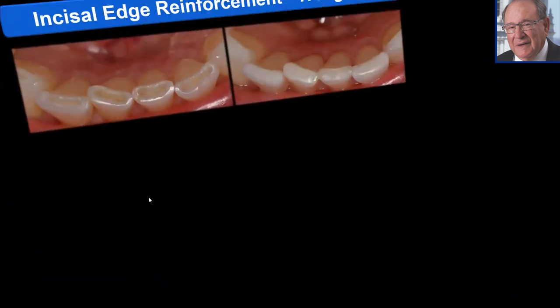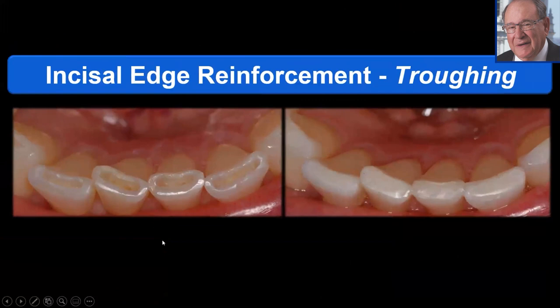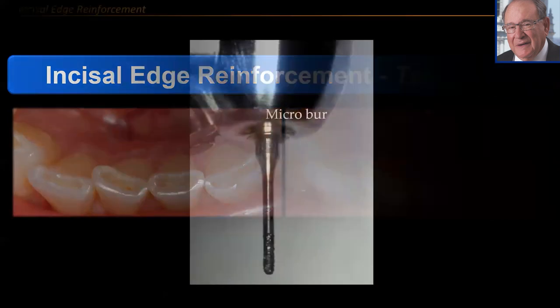Let's go through the procedure. If you take a look at this first slide, you can see I've already got these four teeth prepared — the laterals and the centrals. I'll show you higher powers of the integrity of those enamel walls — it's tremendous. All you're trying to do is preserve the incisal edge of that tooth and stop the wear. If you take a look at the canine, you can see wear on the distal of that right canine. We're going to add to that canine to get disclusion and hopefully stop the bruxism.